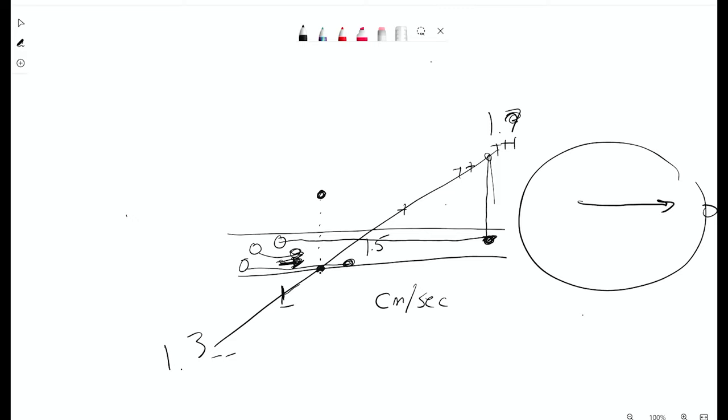Whereas this guy starting out from here and going all the way over here, he, or she, has seen a very, very large change in the magnetic field strength because they're moving so fast. So they are further along. They're pointing over here. Dang, this is like time travel. It actually is time travel. Yeah, that's awesome. How far you travel over time.